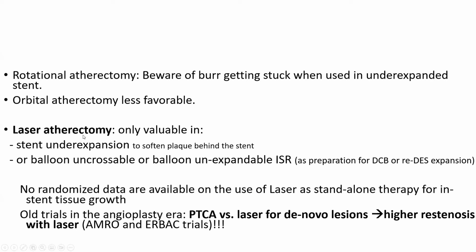Laser atherectomy does not reduce long-term in-stent tissue growth. A lot of people use it for reducing in-stent tissue growth. It has been proven to do that in SFA, in the periphery, SFA restenosis, but not in coronary in-stent restenosis.